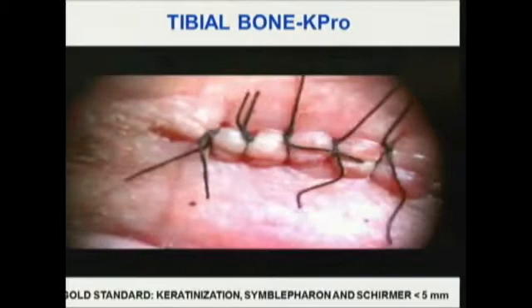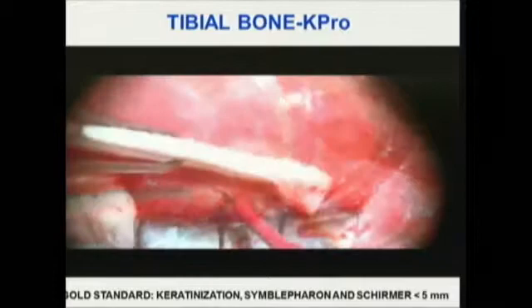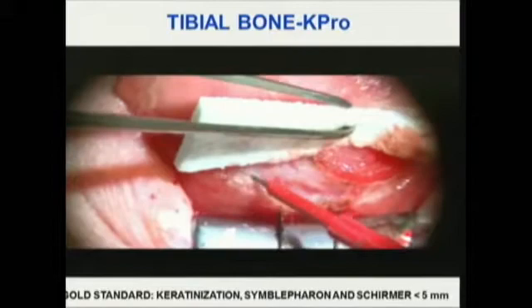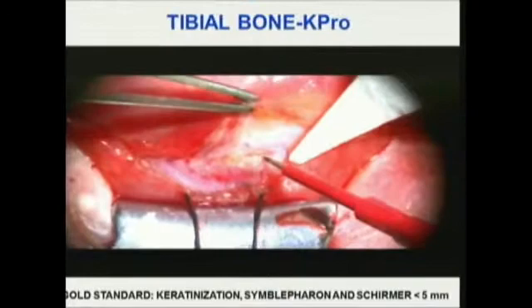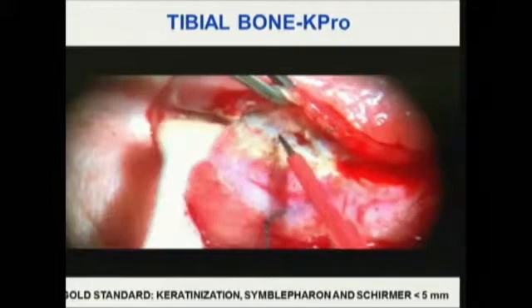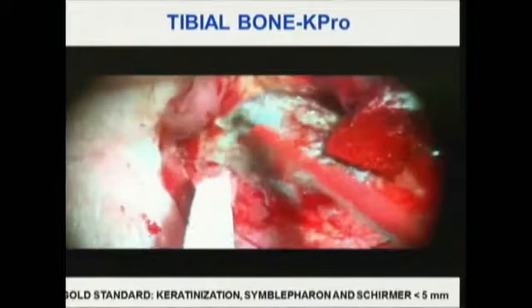After that, this is the most difficult step of the surgery. Three months later, we need to lift the oral mucosa again. It's really difficult because the tissues behind the oral mucosa are thinner. We can use either the Colorado cautery or even scissors. We remove it in more or less 300 degrees, and we only leave the inferior oral mucosa attached to the inferior muscle.